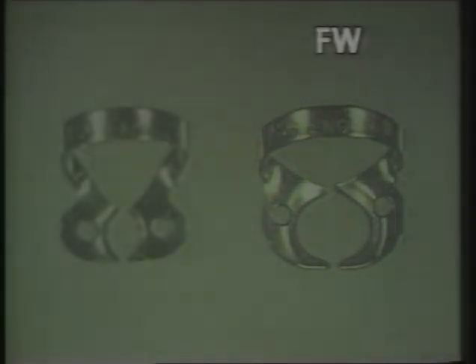The range of clamps to be described are labelled A to K in order of priority. A W appended to a clamp indicates that it is wingless. The AW clamp has curved beaks and is the one you should use in most molar situations. It is a retentive clamp with a 4-point jaw contact. If the tooth to be clamped is on the large side, then an FW should be used. And when the anchor tooth is small in diameter, then the appropriate clamp is the GW.